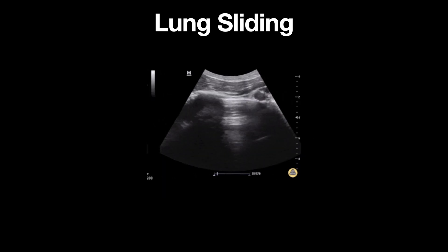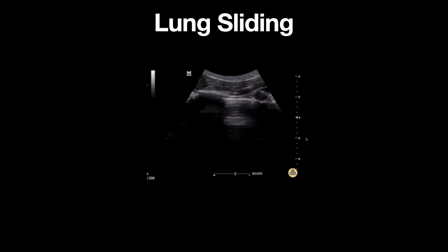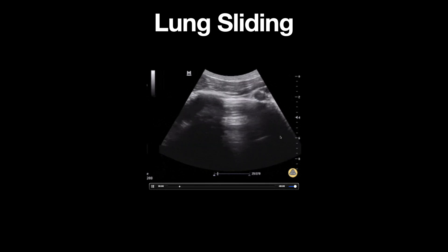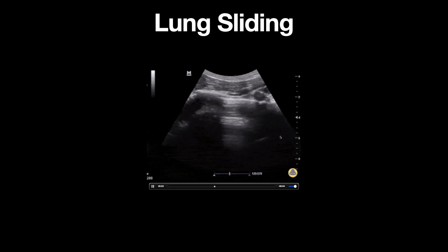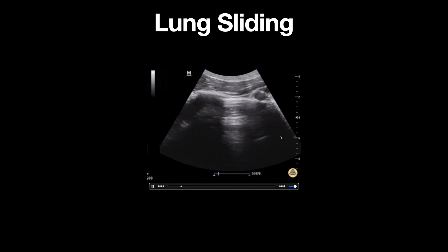One way to improve visualization of lung sliding is to reduce the gain, as seen in this image, which enhances visualization. M-mode can also be used to further evaluate the pleura if lung sliding is not readily apparent.